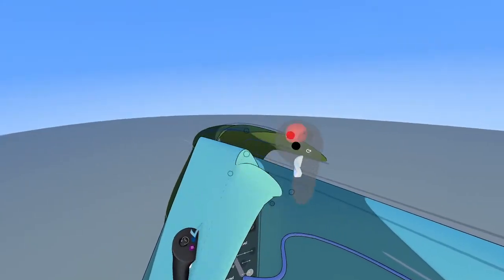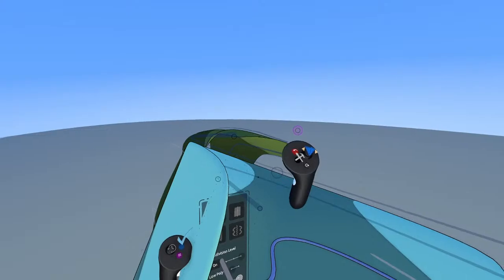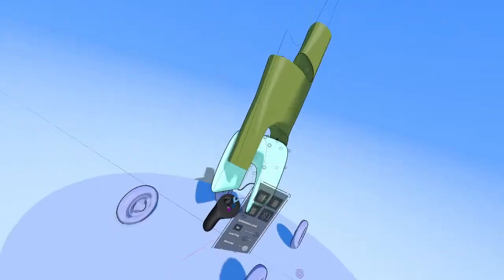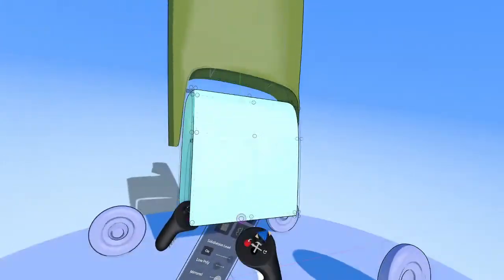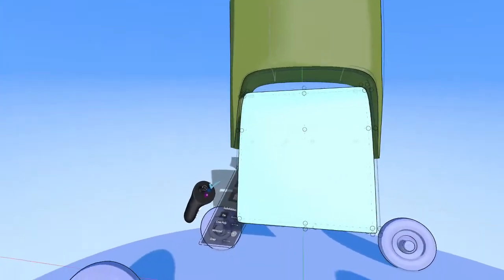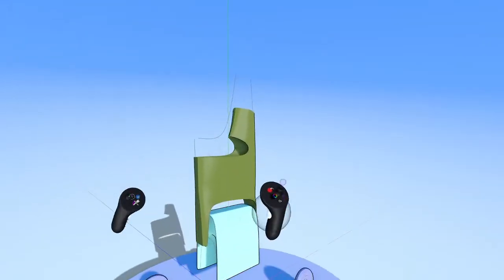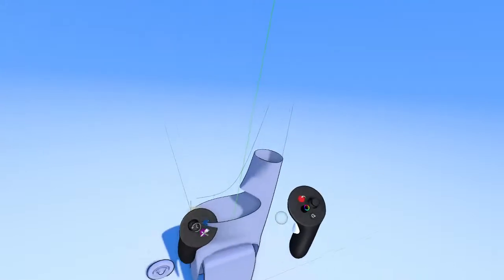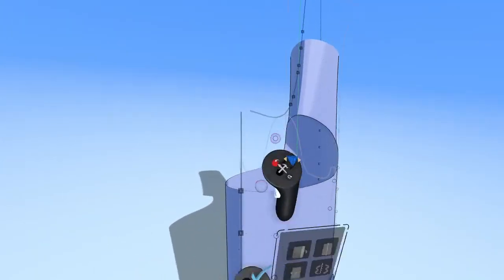I'm going to click that like that, duplicate out an edge, pop it in right there, and delete that extra edit point. And it's not that big of a deal. The shape is still connected together. It still looks decent. All right, let's try and pick up the speed here a little bit.